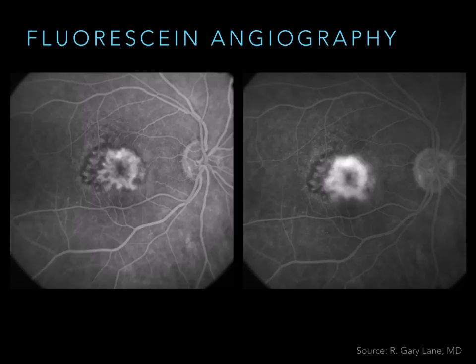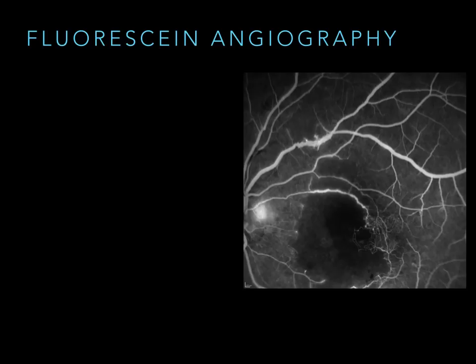So that one's staining. This one is brighter on the right, and it kind of blurs its borders. So we think of this as leaking. And this particular configuration fits a little bit more with a CNV, but other things can cause leaking too, like cystoid macular edema. So when you see leaking, you don't just go CNV or CME. You could even think about other things too. Leaking NVD or NVE causes leaking, but that's obviously not cystoid macular edema. It's obviously not choroidal neovascularization. So you can keep on subcategorizing. This is a good way to think about anything in ophthalmology: take it one level more detail.